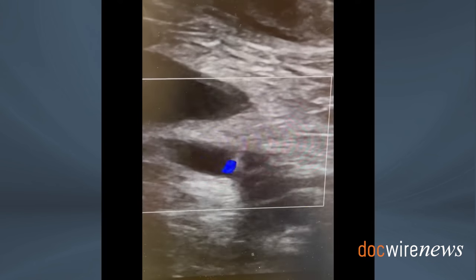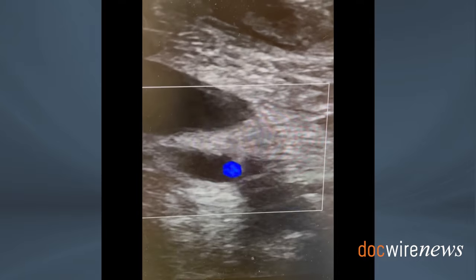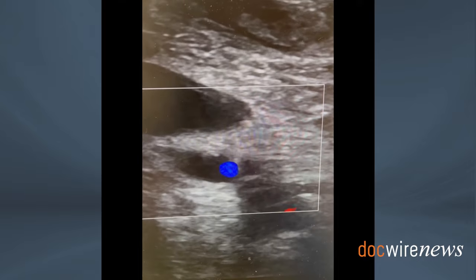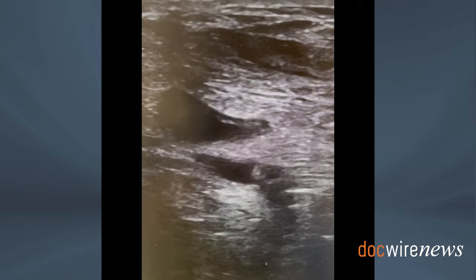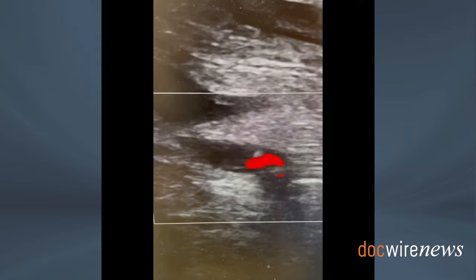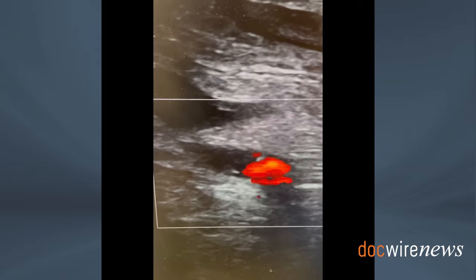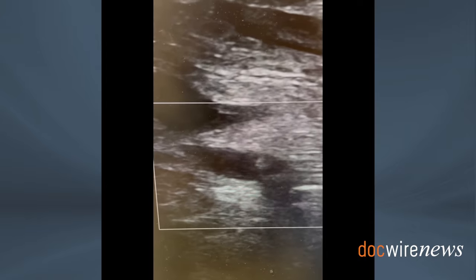Here we elected to inflate a balloon up and over in order to increase the safety of the procedure, since the needle was approaching the artery into that small cavity that was literally very close to the neck. The balloon was inflated to occlude the artery, and the needle tip was placed in the secondary cavity, then 100 units of thrombin were injected in that small cavity in order to thrombose it.